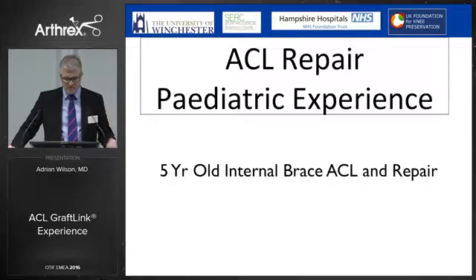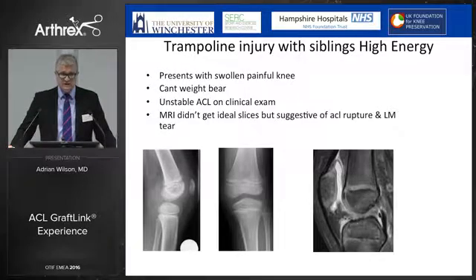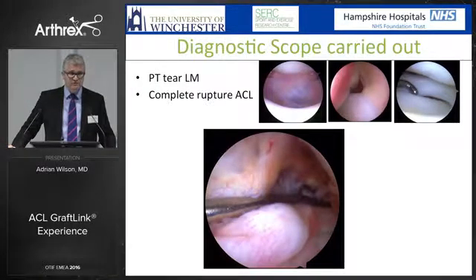And I just want to finish with just a few minutes on repair. Because this is an innovation meeting. So this is a little 5-year-old. I leave the pictures up just to show the physes are obviously open, a skeletally immature 5-year-old child with a complete rupture of the ACL, and you can see that from the images shown.